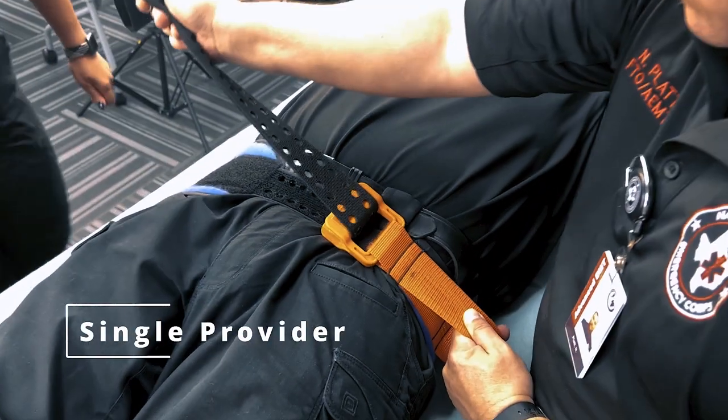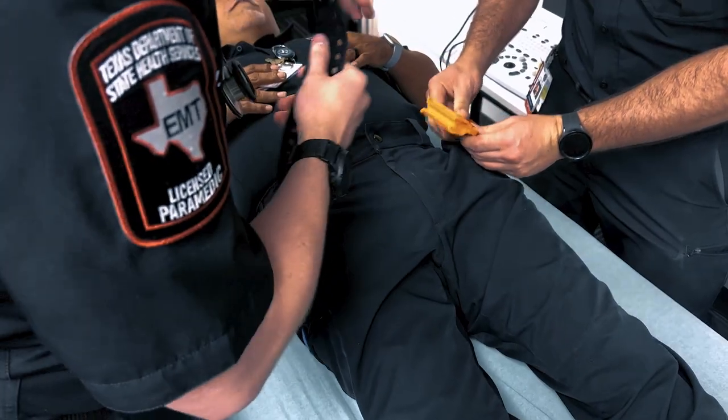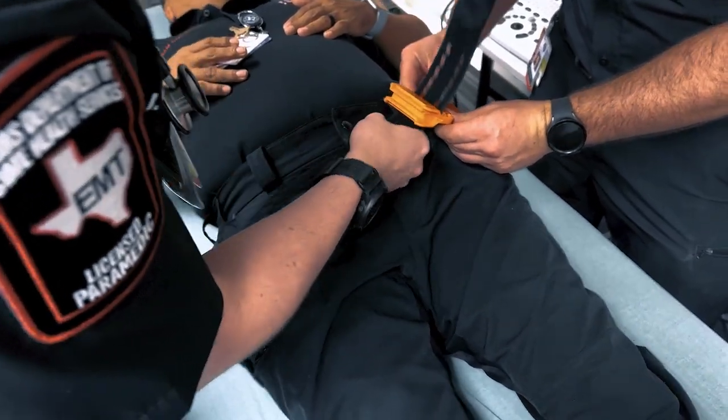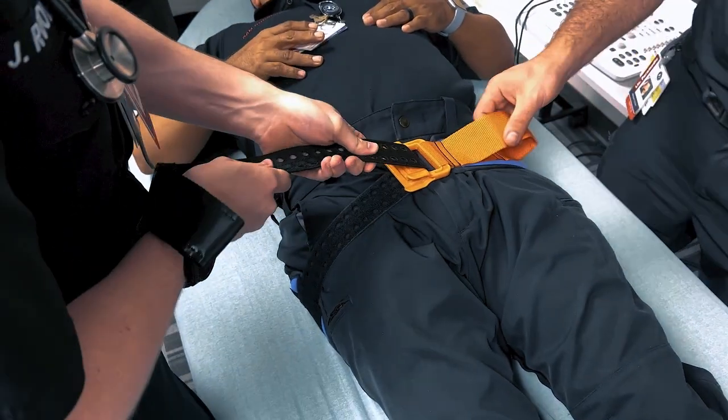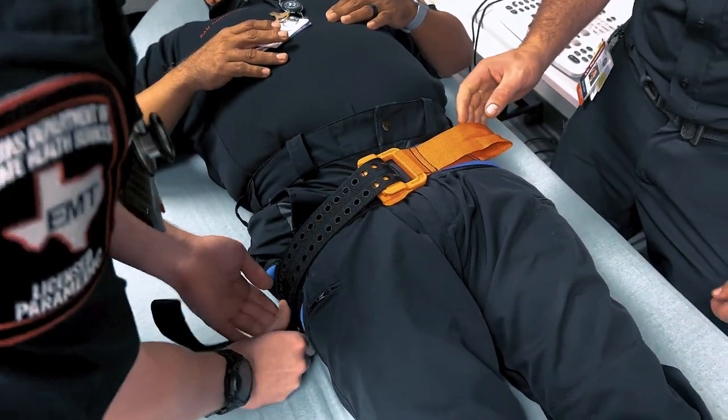Although the pelvic binder procedure can be performed by one provider, it is recommended to have two. When applying a pelvic binder, it is essential to ensure that the binder is properly positioned and secured. Check for any discomfort or restriction of breathing and adjust the tension accordingly.